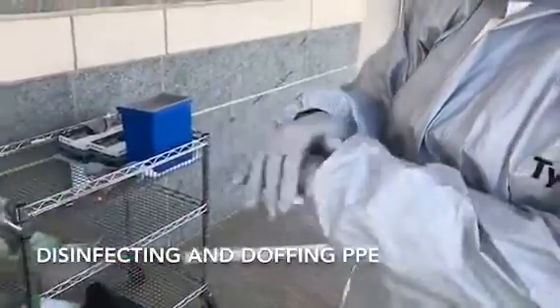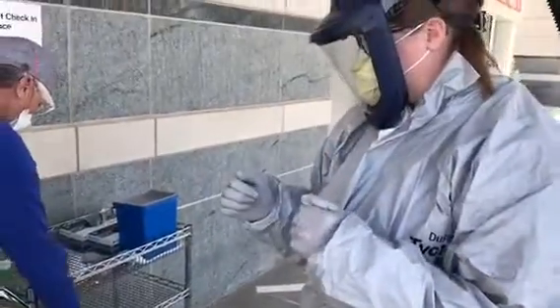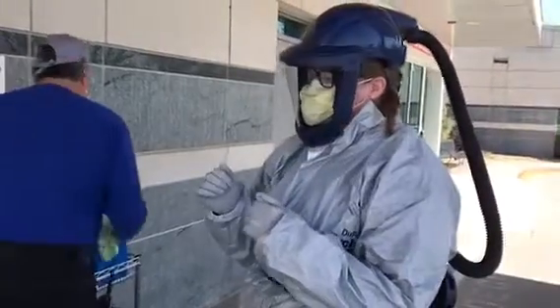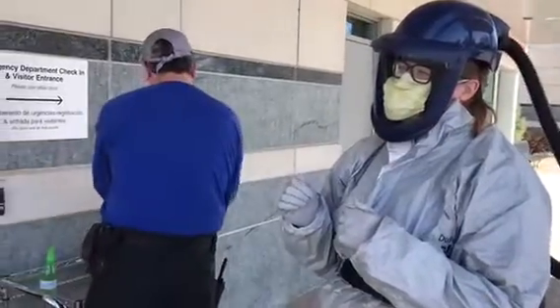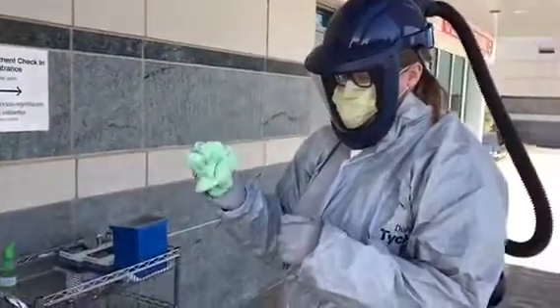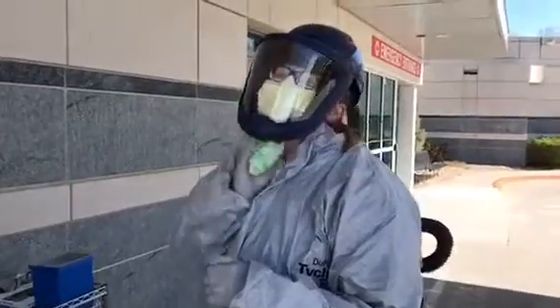Hand hygiene will be performed with the alcohol-based hand sanitizer. A green rag with the Oxicide solution that is damp will be given to the primary nurse to wash her entire body and her hood, starting with the hood of her PAPR.